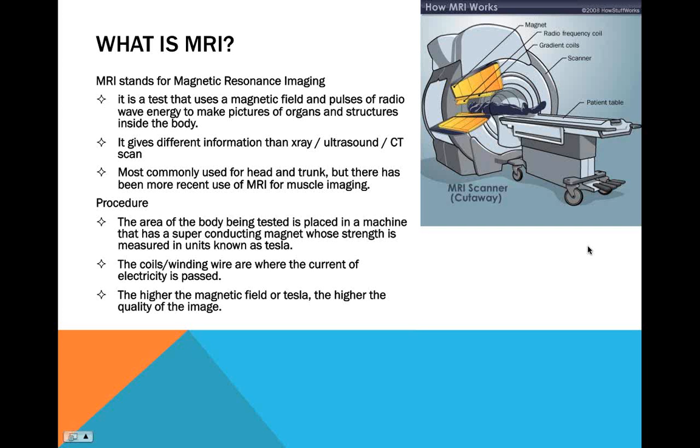Within the neuromuscular community, a lot of the concerns are with regards to scoliosis and surgery for that with rod placement. For the majority of our patient population, they are of the generation where titanium rods have been used, and titanium rods are safe for use within the MRI. The only problem is that it creates some imaging artifact, but it does the job, and it's safe for kids to go into the machine with that.